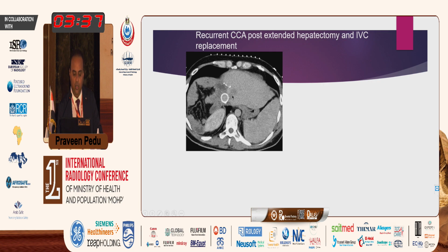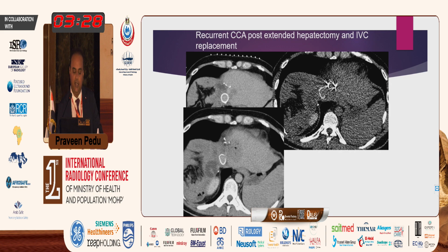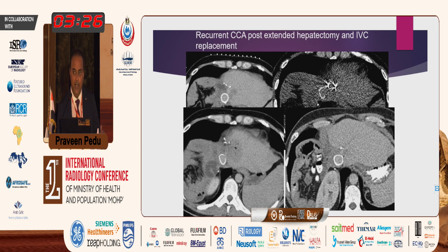So what that meant was we couldn't use a thermal ablation because you could damage the venous outflow to the remnant liver here. So we did IRE again for this patient, and again it produced a good result, and he remained disease-free for about 18 months, and again he developed some more recurrence, which again we treated with IRE, and he still remains alive to this date. This is now 8 years post-procedure.